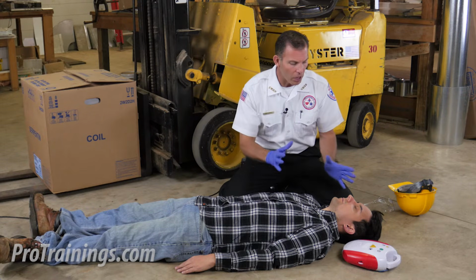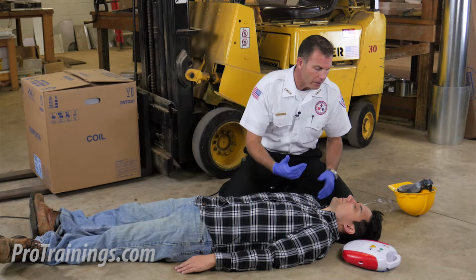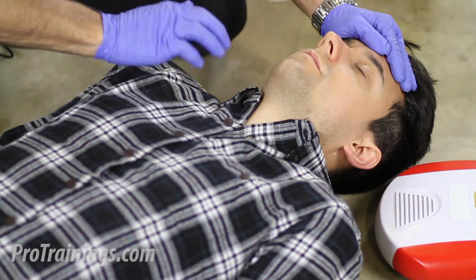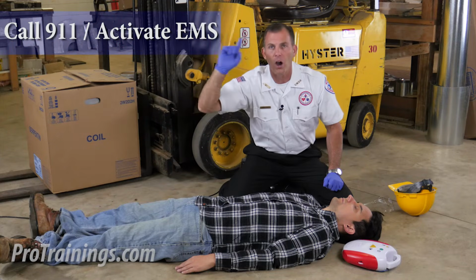So as soon as I call out to the patient, "Hey, are you all right? Can you hear me?" They don't respond. I tap and shout, "Sir, can you hear me?" They still don't respond. I'm going to activate EMS by calling 911.